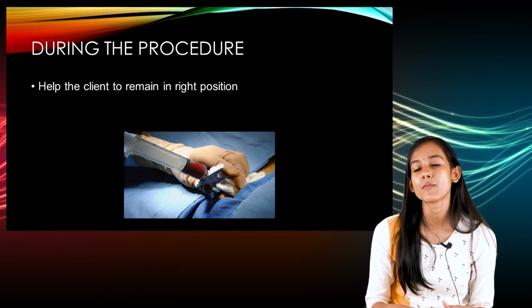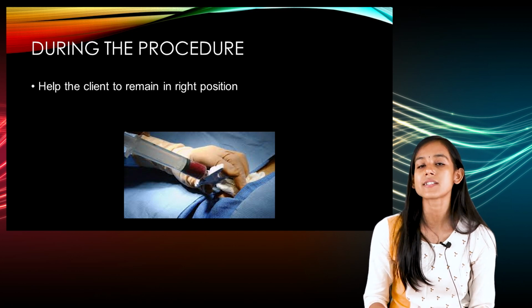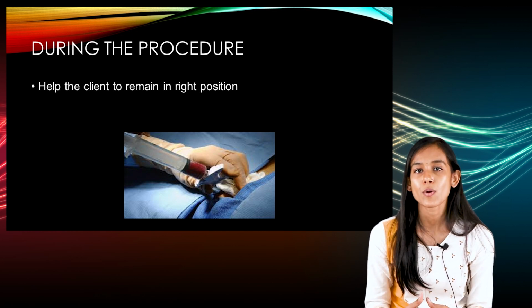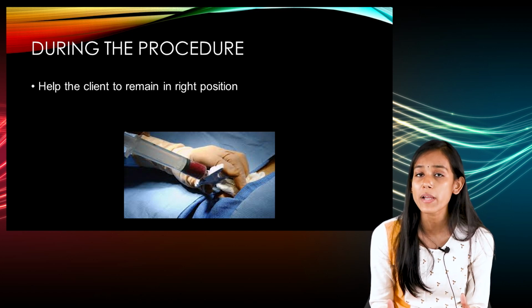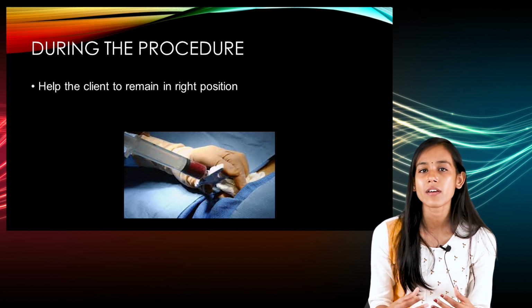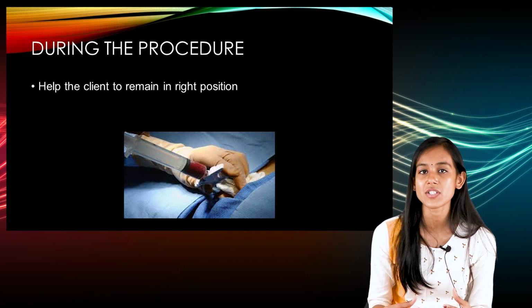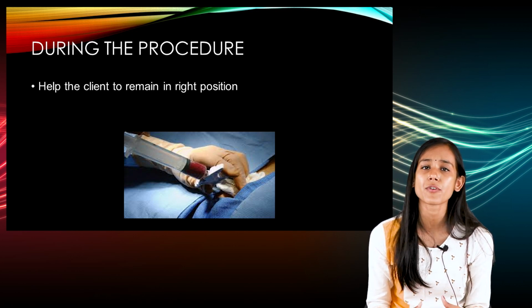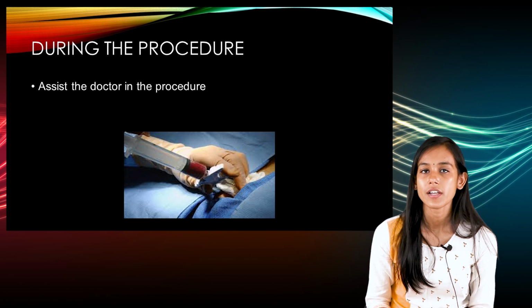And then one more thing that you should do here is to help the client remain in the right position. As we know, this is an invasive procedure and this might cause pain, right? And we have a pediatric patient here, so it is very important to immobilize the patient appropriately. But also, if the patient is having pain, there is a chance that the patient might move around. So to prevent that, you have to help the patient remain in the right position. And then you have to assist the doctor in the procedure.